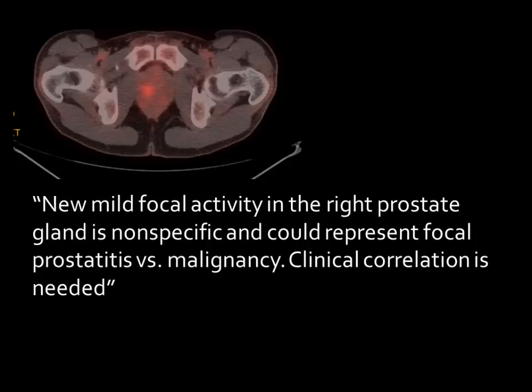The question in this case is, when we say clinical correlation is needed, what sort of clinical correlation are we thinking of? What could be done to differentiate focal prostatitis from occult malignancy? And the answer to that is not clear to me.